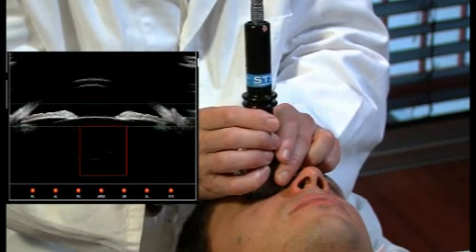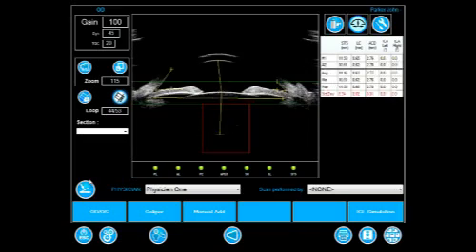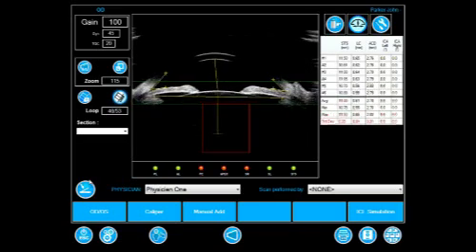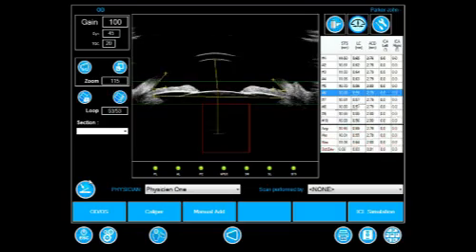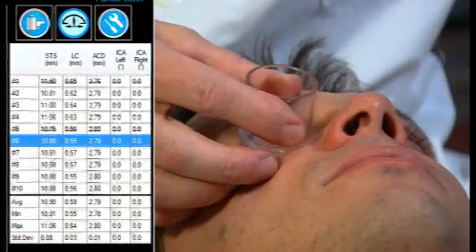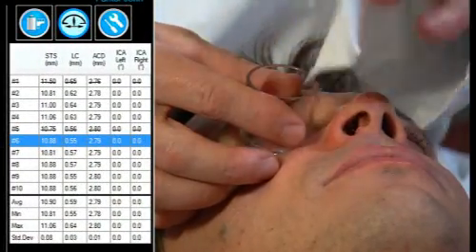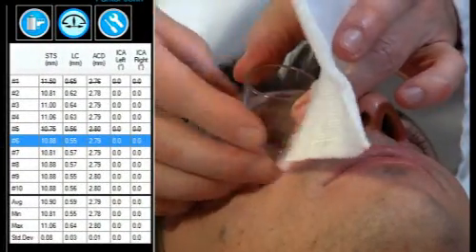The software automatically calculates the average measurements, eliminates the two extremes, and then selects the scan with the values that most closely match the average.